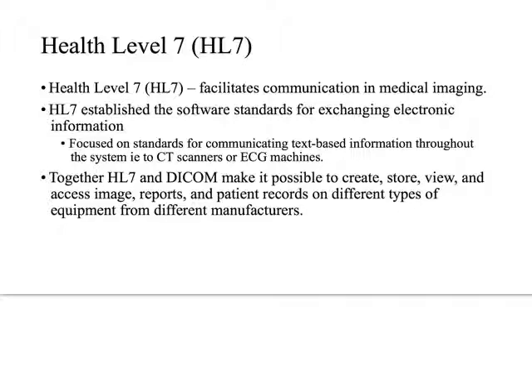Health Level 7 is actually an organization, and they work to facilitate communication specifically between software systems in text form. So it's significant that this is a text-based system. You don't want to confuse it with DICOM or something like that. It's text-based information. And so this is what, for example, the RIS uses to communicate the patient information to the CT scanner, or even to an EKG, ECG machine or what have you.